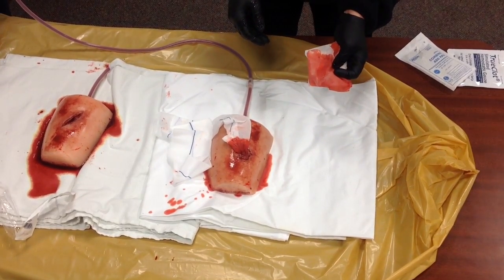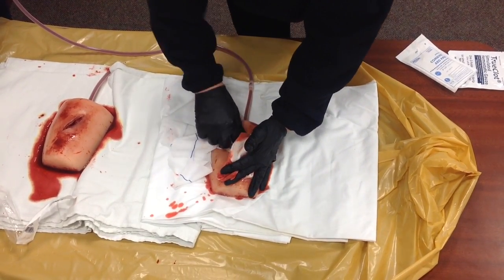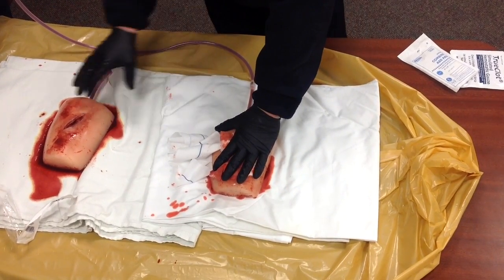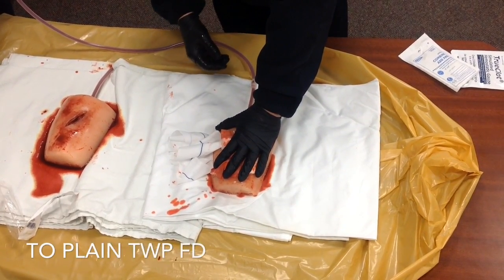If it continues to bleed, add a little more gauze and continue to hold direct pressure. Again, this technique is not for a limb — it's for somewhere on a large body surface where you cannot use a tourniquet.